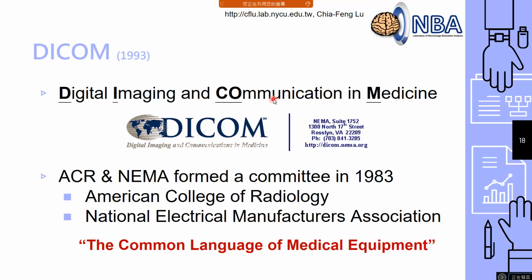What does communication mean? It means if we'd like to send a medical imaging from one machine to another one, for example, from the MRI or CT machine to the server, so I can let a doctor check the imaging and give his comment on it. This kind of transmission of the file is so-called communication.